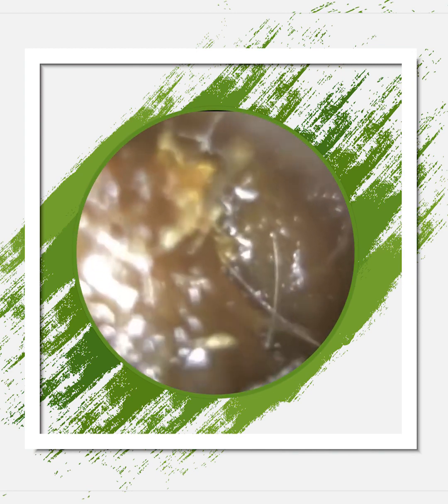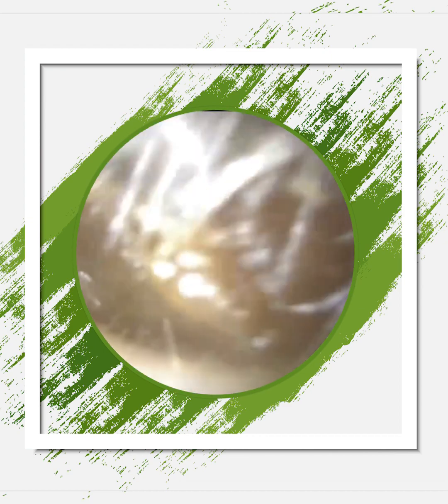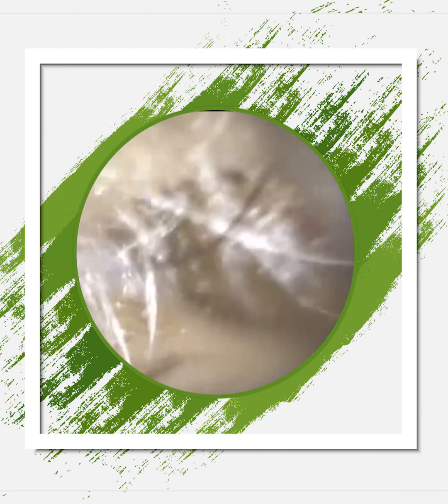Although it looks still quite, there's a bit of wet wax still there, but we're happy with that. And when you're having your ears cleaned, it can be a bit noisy as well. This patient was a bit unstable, they're an elderly patient, so we don't want to prolong a procedure just for the sake of it. So in that case, we're really happy with that.